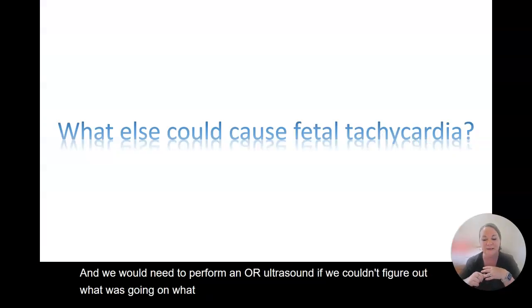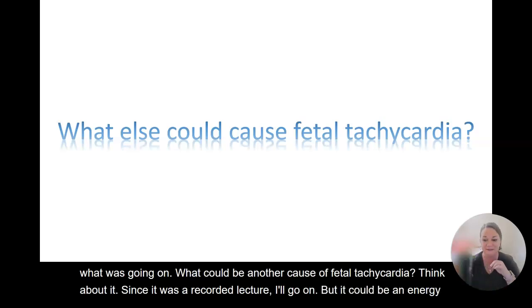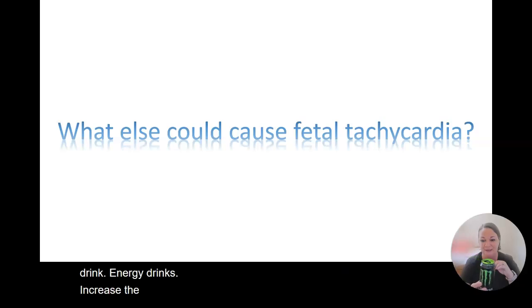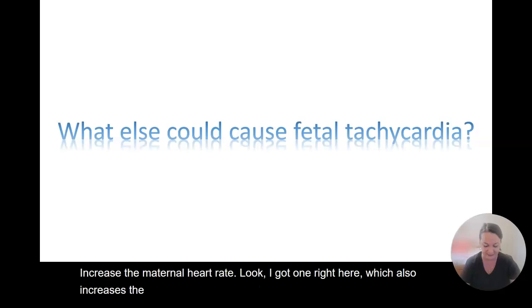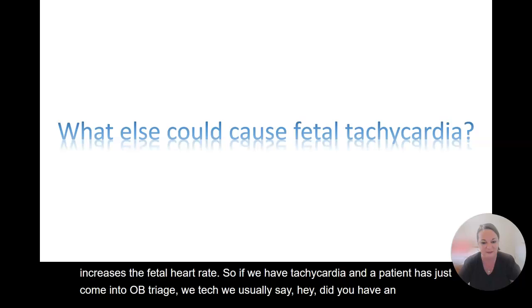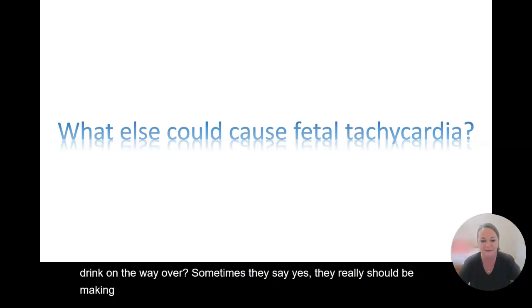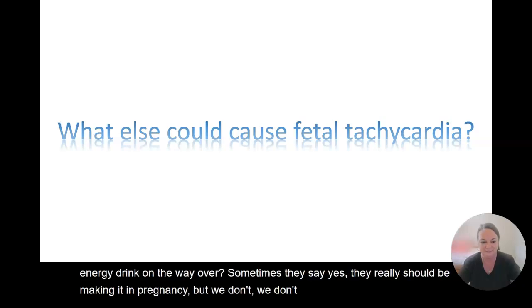What could be another cause of fetal tachycardia? Think about it. Since this is a recorded lecture, I'll go on. But it could be an energy drink. Energy drinks increase the maternal heart rate. Look, I got one right here. Which also increases the fetal heart rate. So if we have tachycardia and a patient has just come into OB triage, we usually say, hey, did you have an energy drink on the way over? Sometimes they say yes. They really shouldn't be drinking it in pregnancy, but we don't judge them, right?